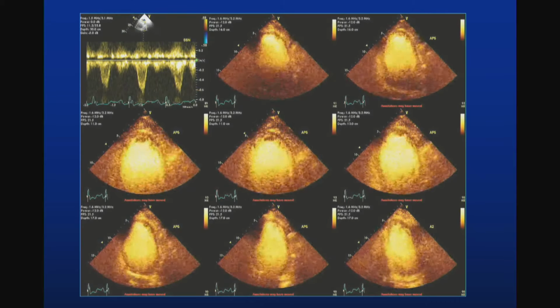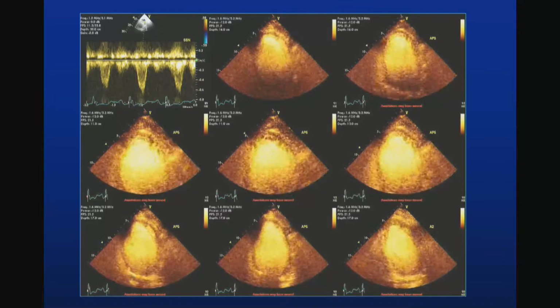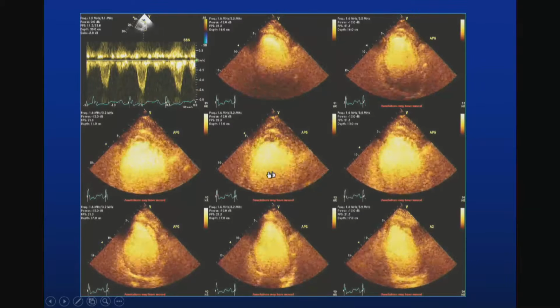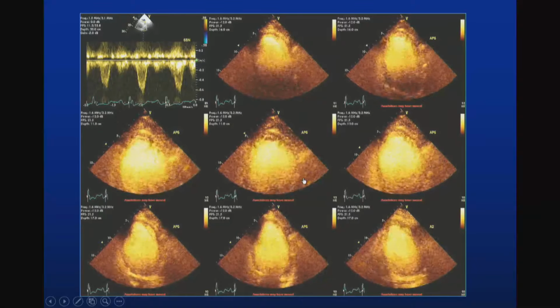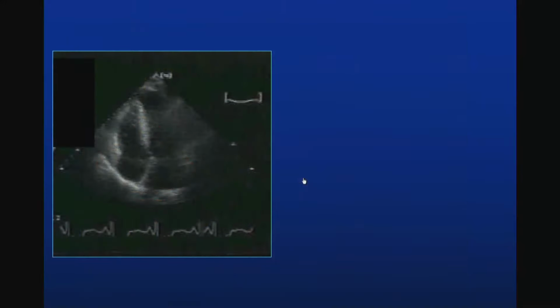Contrast will enhance the imaging overall. And there is a surprise, obviously a thrombus at the tip of this heart with a negative contrast in it. Also I can tell that the anterior wall and all looks like a diffusely abnormal heart with some areas of akinesis, but certainly there isn't a single segment that contracts well at all.